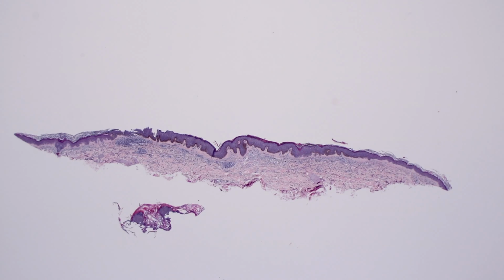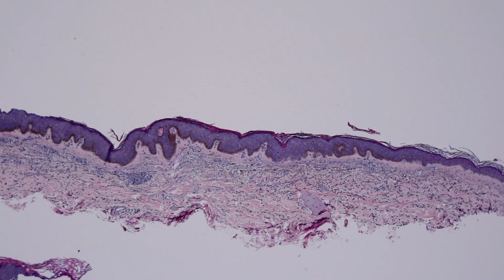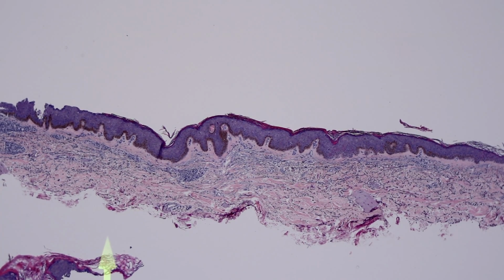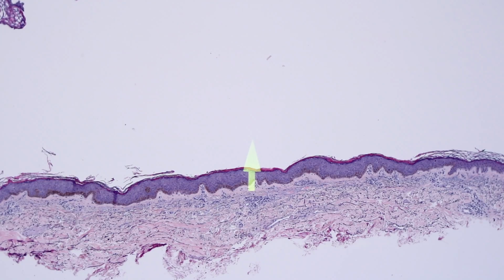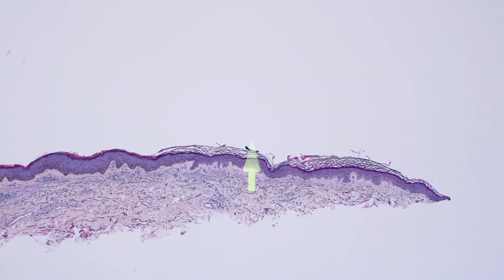This was biopsied as a rule out dysplastic nevus versus melanoma. And the reason is, look at that basal layer, super pigmented. So the basal keratinocytes are very hyperpigmented in this lesion. And if you just focus on that, you might think it's a lentigo or a seb. But look at, for one thing, the corneal layer changes. Here's the basket weave corneum from the normal skin.